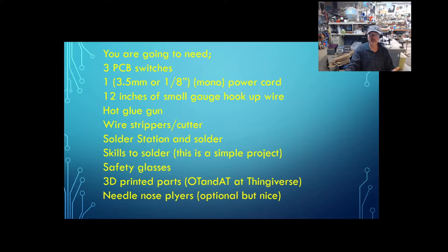What else you're going to need here, you're going to need these what's called printed circuit board switches, three of them. They're really cheap. You're going to need three of those things. One cord, which you're going to cut in half to make the connecting cord for it. And it's got to be, they go by 3.5 millimeter or 1/8 inch mono, they're called. 12 inches or so of small gauge hookup wire. And this could be multi-stranded or it could be solid wire. Solid wire strips much easier. And in this case, since there's no movement, it will be just fine. I usually don't recommend solid wire in case there's any movement because it will break quickly.